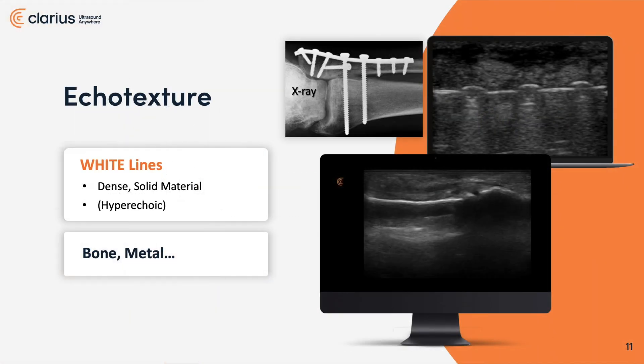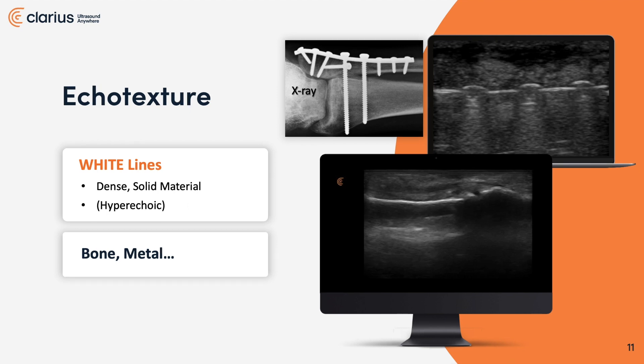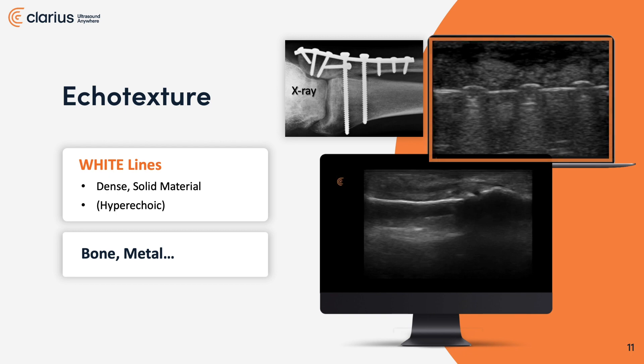Speaking of density, let's get right into echo texture. As you can tell by the top image, that x-ray clearly shows a plate on the lateral aspect of an ankle. The ultrasound image below that in the orange frame shows the top three screws in that metal plate. Those top three screws along with the plate offer something below them that we call ring down — it's a signature for metal or hardware.